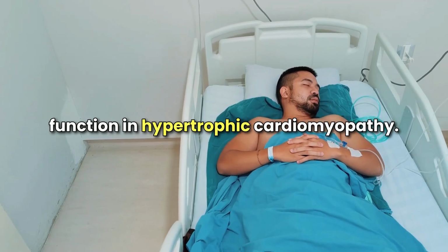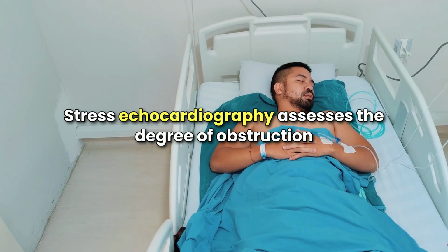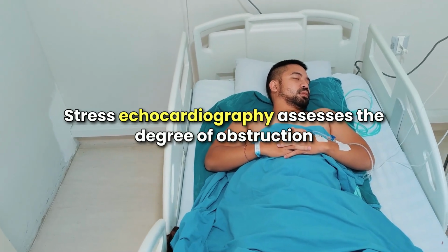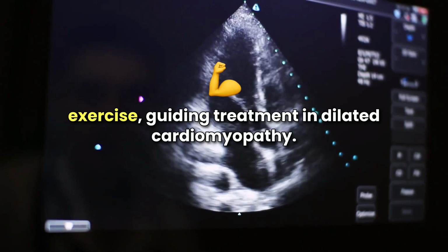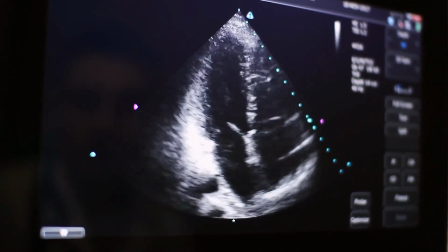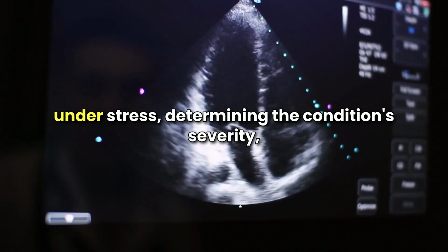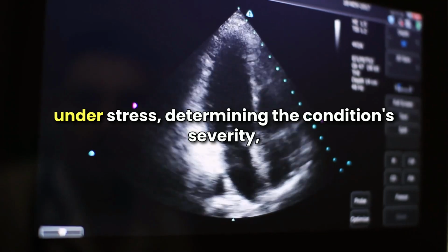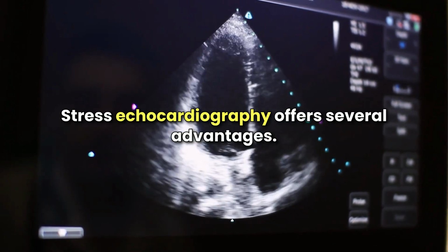function. In hypertrophic cardiomyopathy, HCM, stress echocardiography assesses the degree of obstruction in the left ventricular outflow tract during exercise, guiding treatment. In dilated cardiomyopathy, DCM, it evaluates the heart's pumping ability under stress, determining the condition's severity and informing treatment plans. Stress echocardiography offers several advantages.